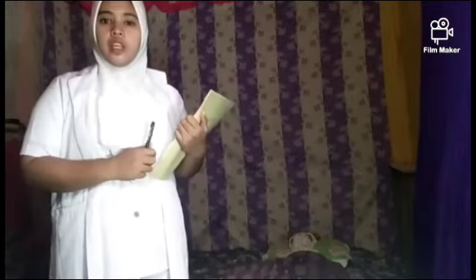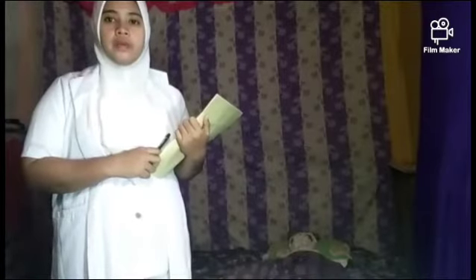First, review the client health record and check the client chart for physician's order. The rationale for this is the catheterization is only done if with medical order. Identify the client and establish rapport. The rationale for this is to ensure the right client and elicit cooperation.